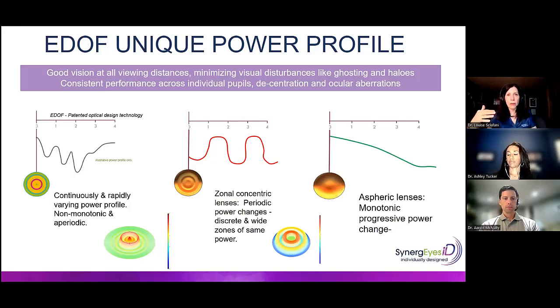So it really modulates as far as the direction of the focal point. And the other thing that it does is it's not a fixed width. These modulate as well. And you might say, well, where did this come from?